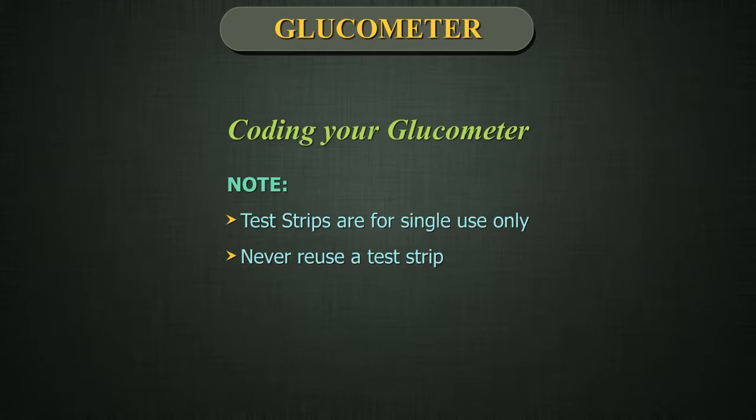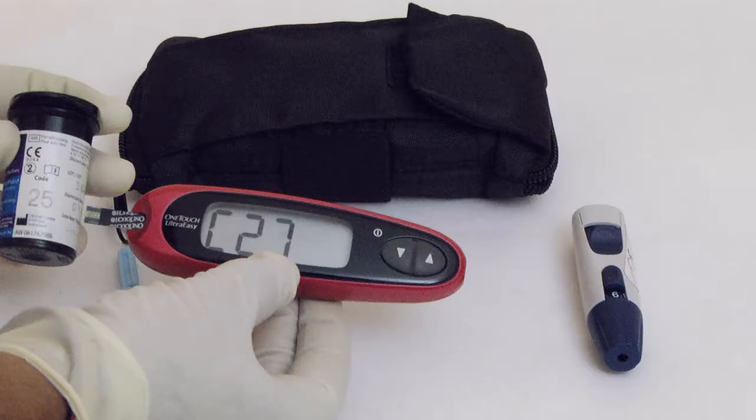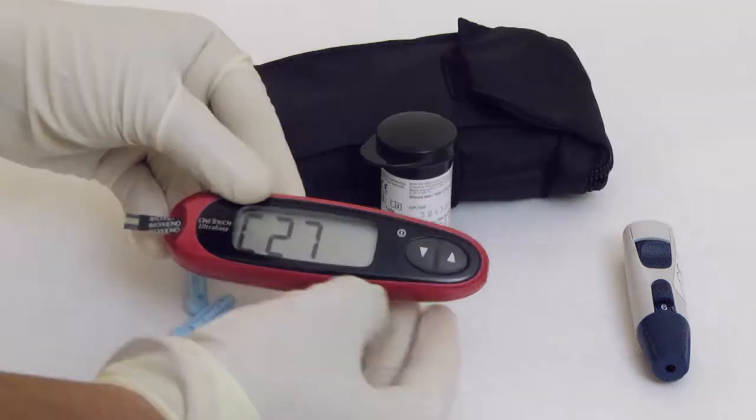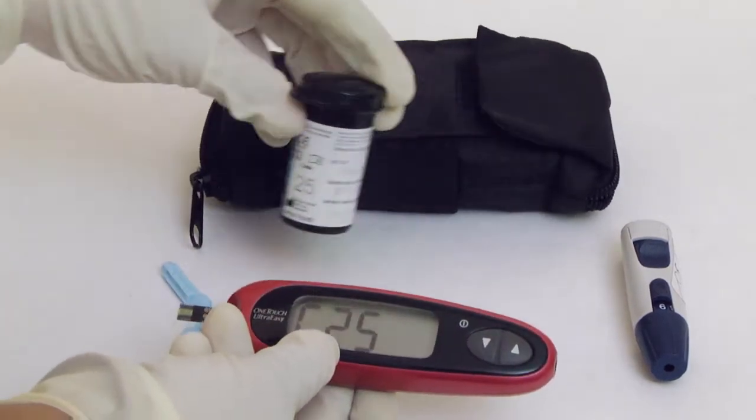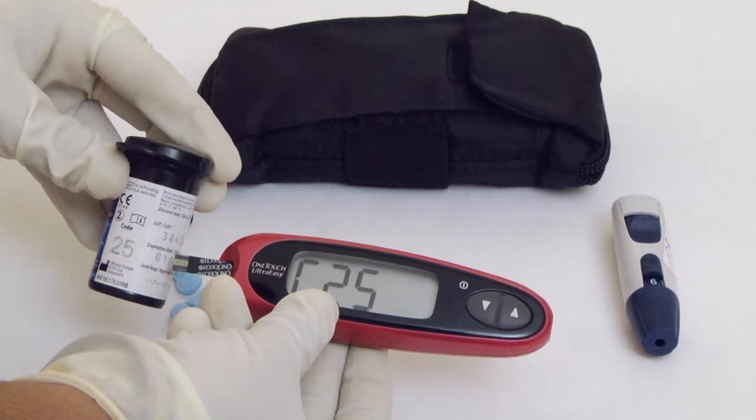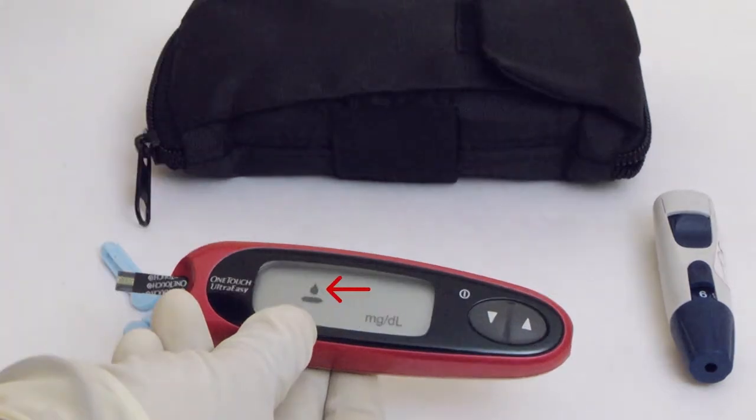Test strips are for single use only. Never reuse a test strip. After the start-up test screen appears, the meter will display the code from your last test. Match the code on the meter with the code on the test strip vial by using the keys on the glucometer. The display will advance to the screen with a flashing blood drop icon.